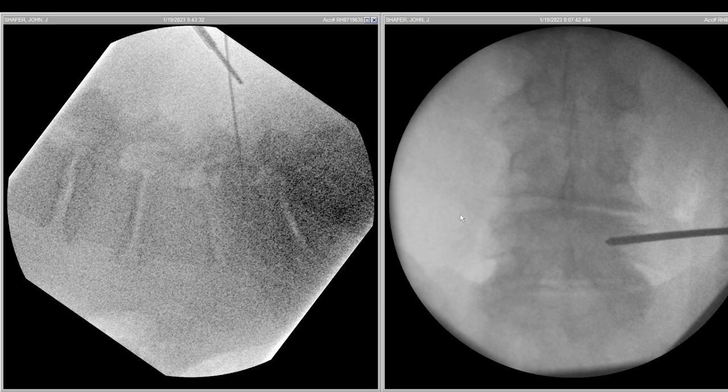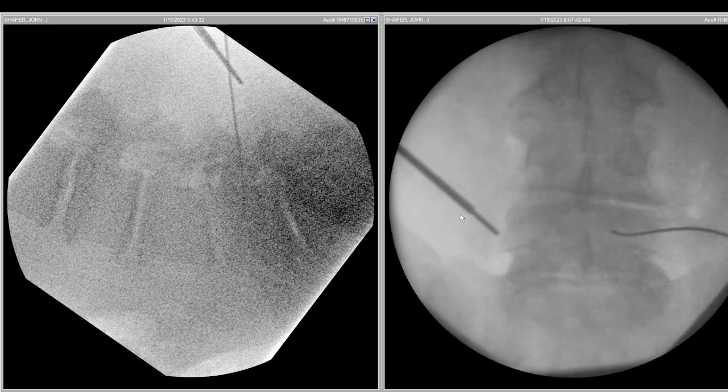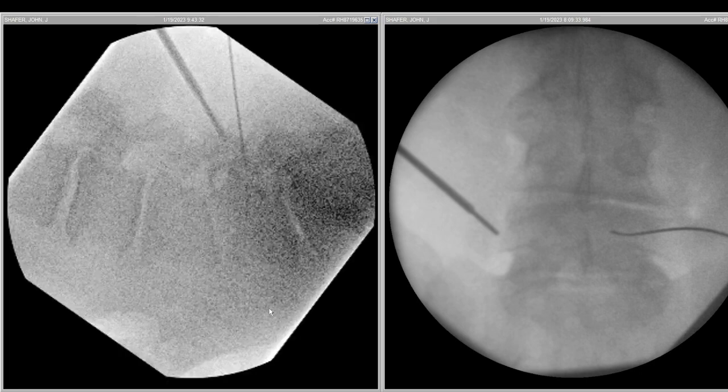We take bone marrow to mix with our biologic, then we approach the discs. In this patient, practically all our instruments are sitting directly on the skin in a very significant way.